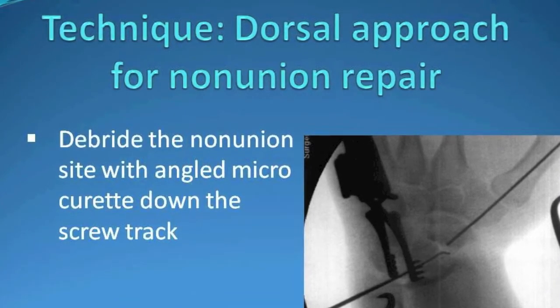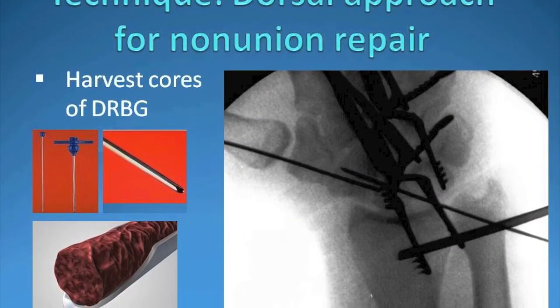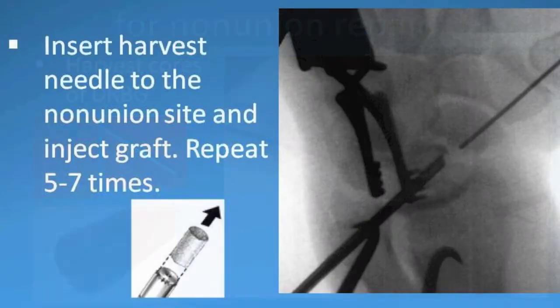At this point, cores of bone graft are harvested from the distal radius and injected at the level of the nonunion. We continue to harvest and inject until basically the bone has been filled from inside out. The fact that the cartilage cap is intact means bone graft doesn't extrude.